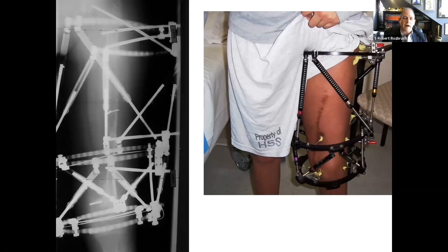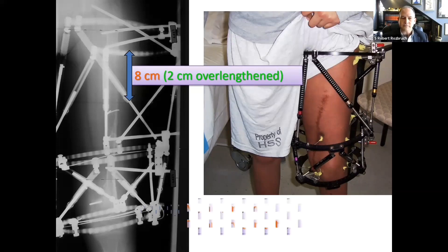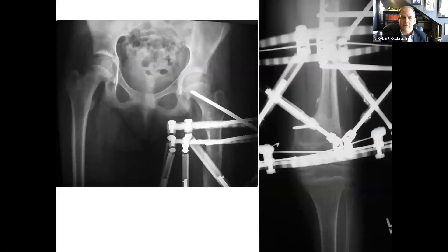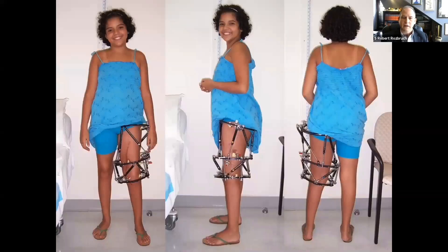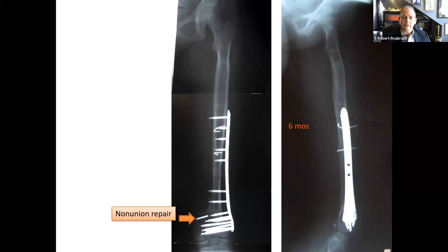The approach here was a bifocal approach at two levels. The proximal level involved an 8-centimeter lengthening of the femur, over-lengthened by two centimeters to anticipate the amount of remaining growth absent in the distal femur. There was also non-union repair and correction of the deformity at the distal femur junction. You can see the fixation in the proximal and distal femur as healing progresses. A plate and screws were added to protect the non-union repair, and you can see the 8 centimeters of new bone regenerate in the proximal femur.